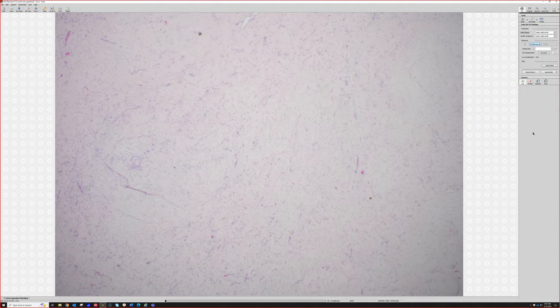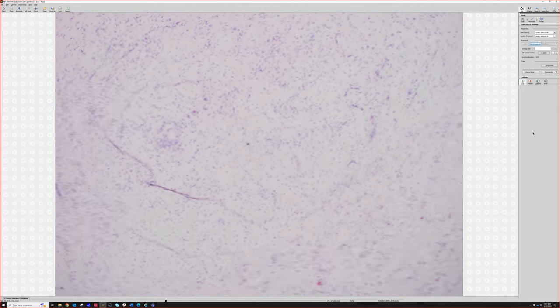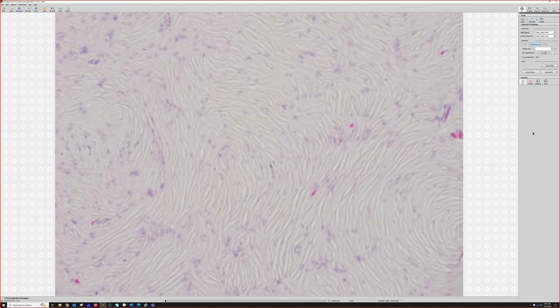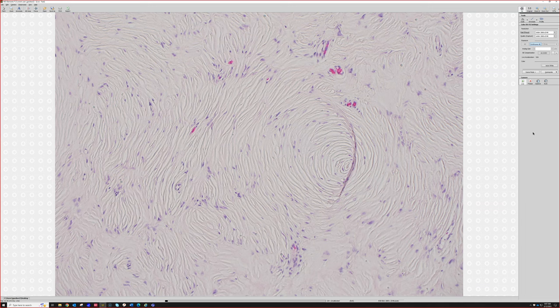Hypocellular pink nodule, spindle cells. Here, I'll flip the condenser. That's a little helpful sometimes. Sclerotic fibroma. Very good. Sclerotic fibroma. It's got the swirling, whirling pattern that some people have likened to the wood grain or plywood appearance. And then it's collagen with cracks in between. So these cracks and collagen swirl together with a plywood appearance.